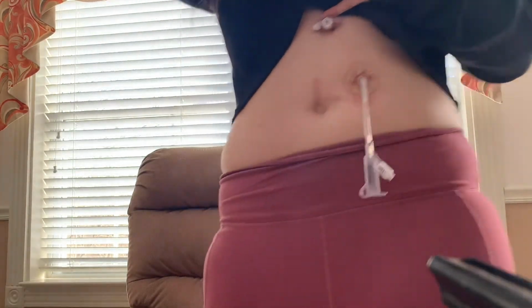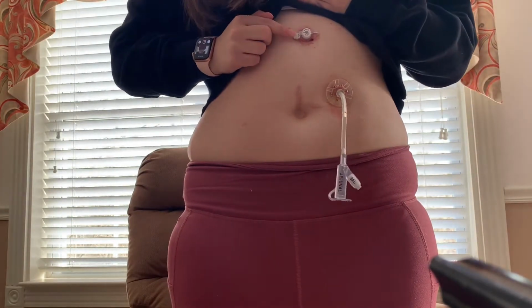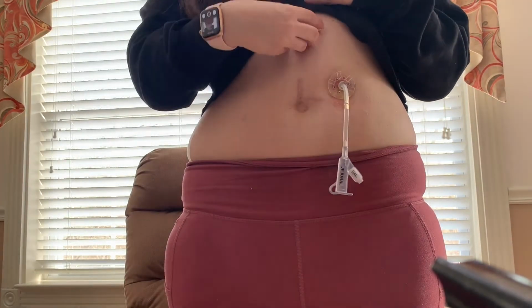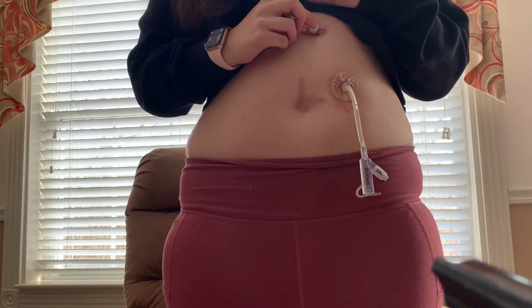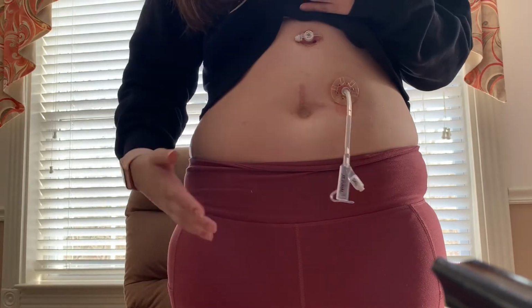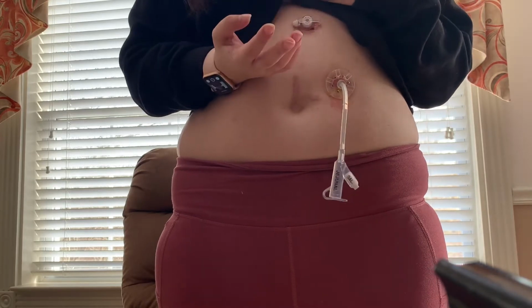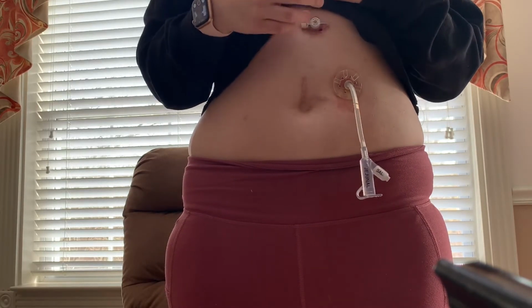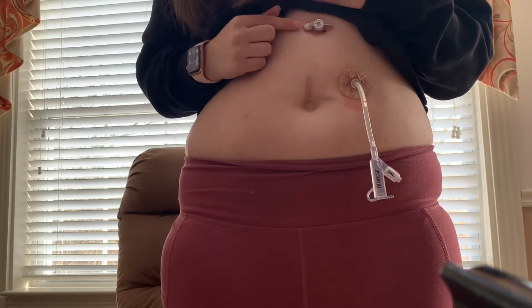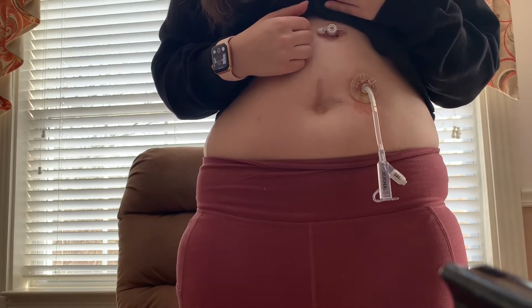Then I have this G tube, this button. And this is so I can drain. Basically, I attach a tube into it. This opens. See, this opens. And I attach a tube inside. And then I drain if I have a lot of gas or if I'm really nauseous. I can drain liquids that I've eaten. I can drain gas. Surprisingly, it sounds so funny when I have it and all the gas comes out. It's actually crazy. But this is to manage my symptoms. So I never feed through this because this is into my stomach. And yeah.